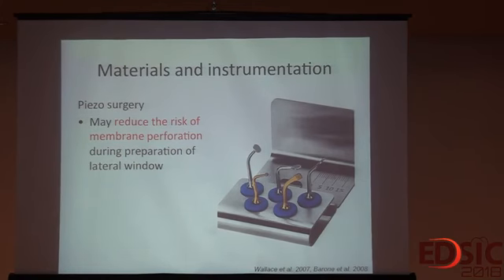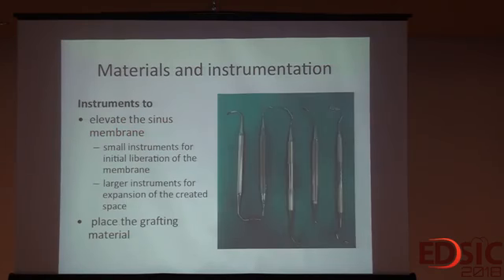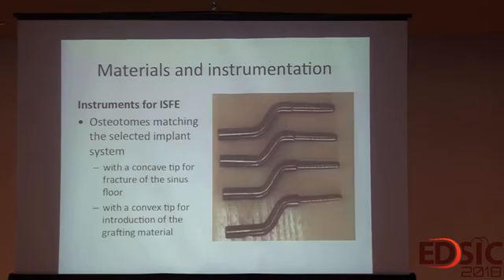Piezoelectric surgery is also used to prepare the window, and it may reduce the risk of membrane perforation during the preparation of the lateral window, but it doesn't reduce the risk of membrane perforation during the elevation procedure. These instruments are also used to elevate the sinus membrane and place the grafting material. The small ones are used for the liberation of the membrane, and the larger ones for the expansion of the created space.